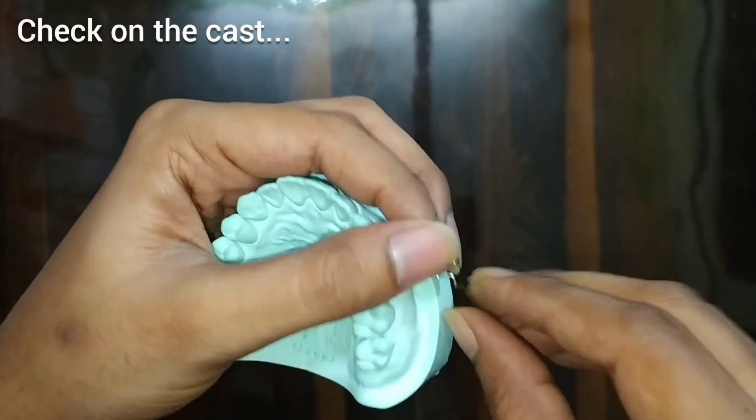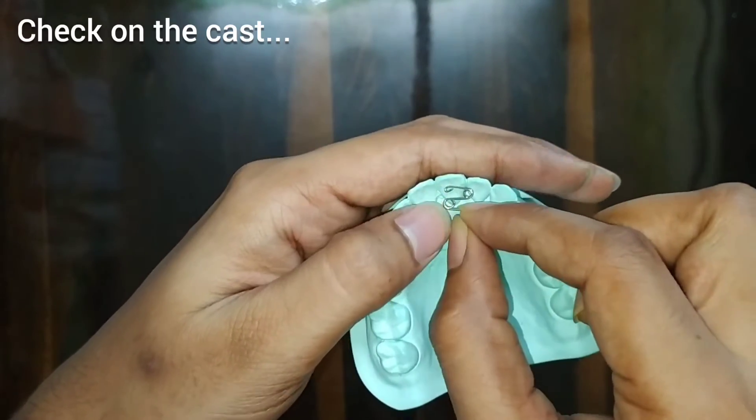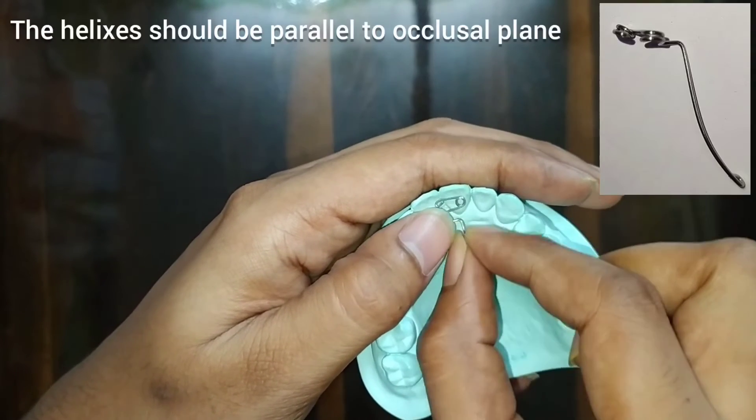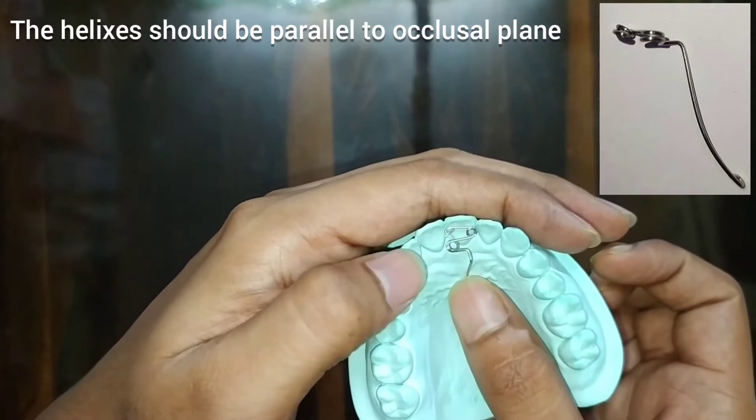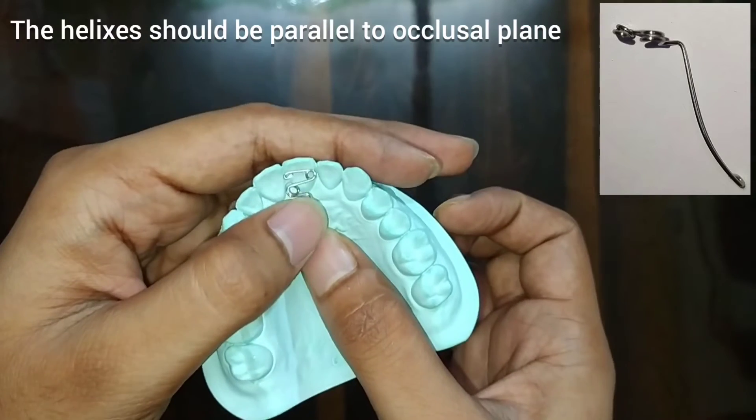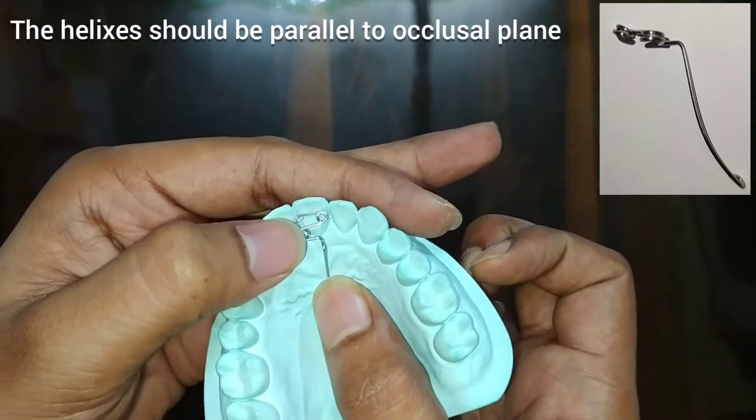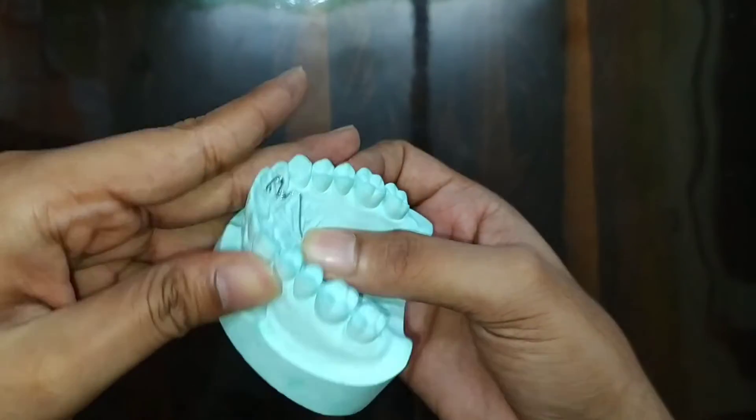We will check it on the cast. Make sure that the above portion is in the plane with the occlusal plane. You can see here there is a gap. The gap is necessary. It should not touch the ruges and all.